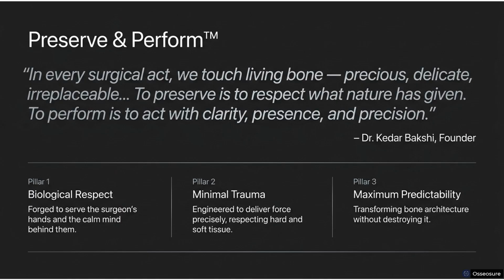The second pain point is the sinus. When available bone under the sinus is 5 millimeters or less, a lateral approach becomes necessary for most dentists, and this approach is not easy for everyone to take. The third pain point is ridge width. After extraction, if available bone in width is 5 millimeters or less, it becomes equally challenging.